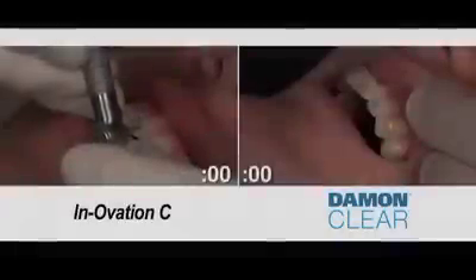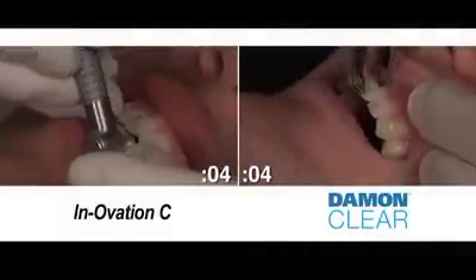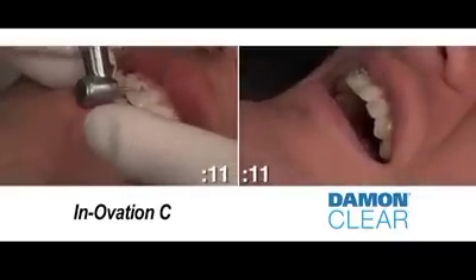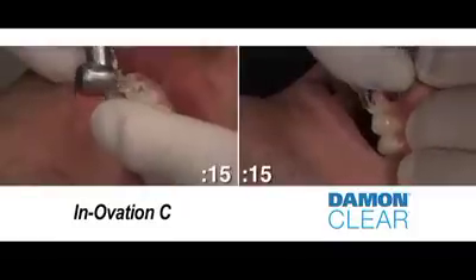The debonding procedure on the left follows the Innovation C recommended protocol, which requires flash removal as part of the debonding process. On the right, the recommended protocol for Damon Clear debonding, which does not require flash removal prior to debonding.